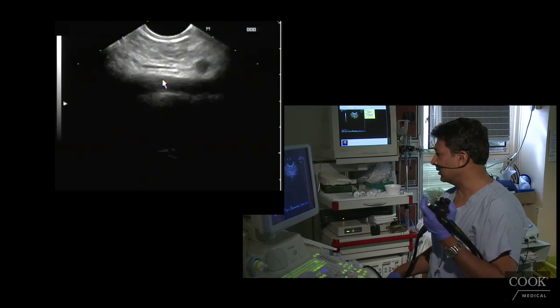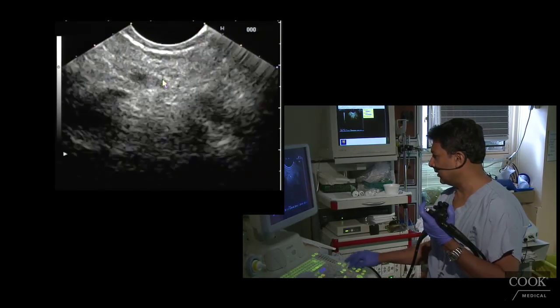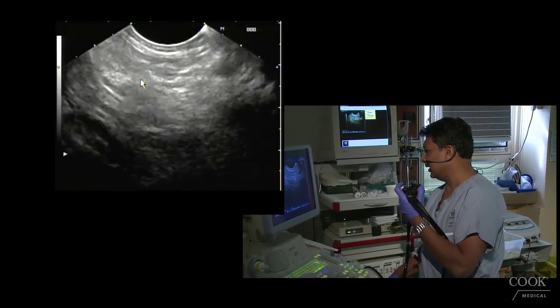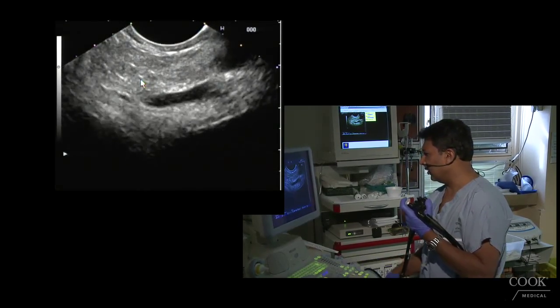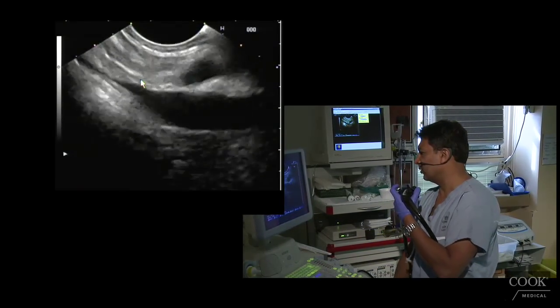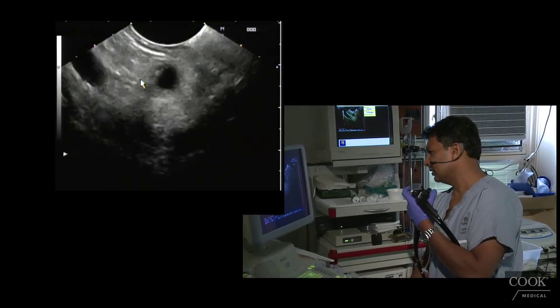Right away, the parenchyma looks a bit like chronic pancreatitis, actually quite a lot like chronic pan. And there's his pancreatic duct. We're going to follow that out to the tail. If you want to get a longer view of the duct, give it some left on the left right. Lock it with your thumb and then just torque, and you'll get a longer view of the pancreas like this.